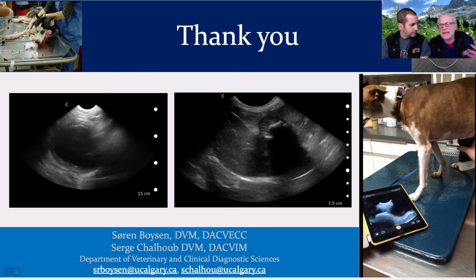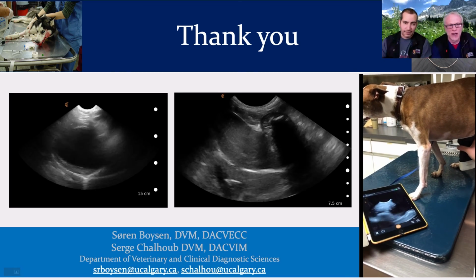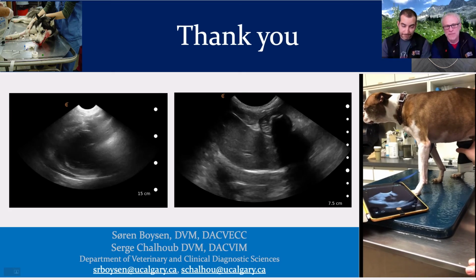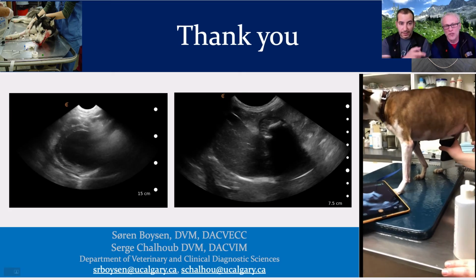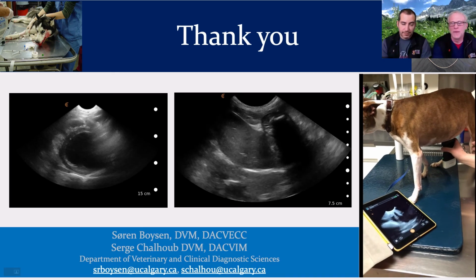It's almost limitless what we can do as an extension of the physical examination to figure out what's going on. We can see that we've got a heart here that you can also pick up. We can do that in a matter of seconds. We can actually assess multiple things. We can also rule out pericardial effusion like you see here. This dog here, we've got the probe on him. He's got fluid in the abdomen.